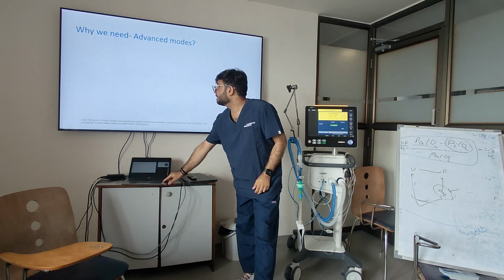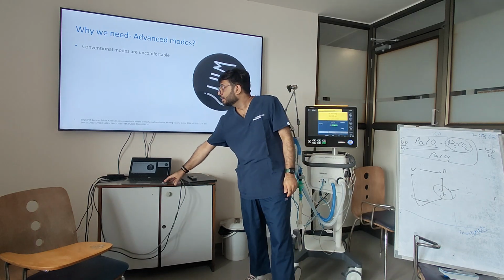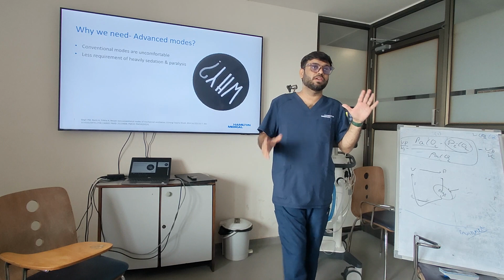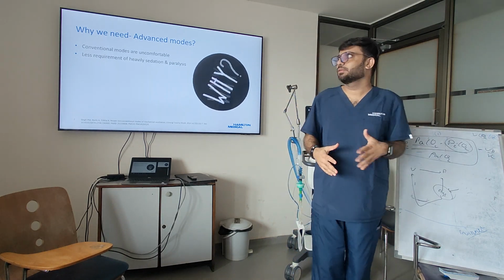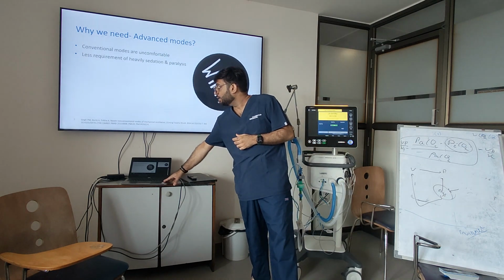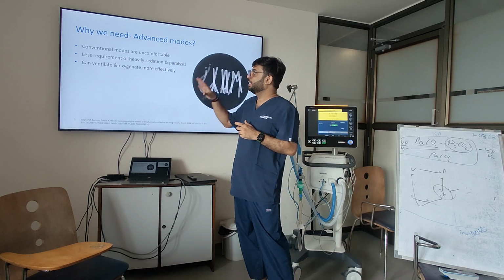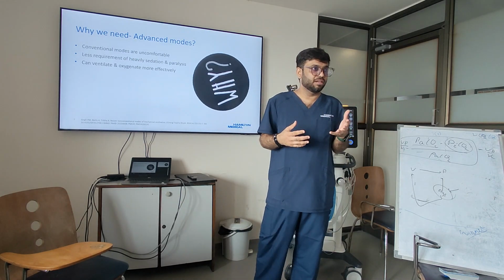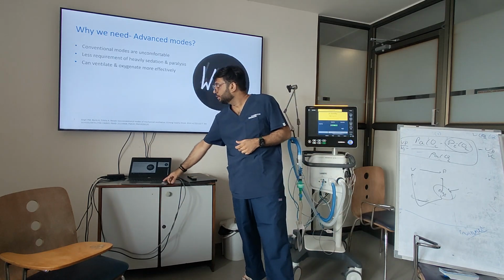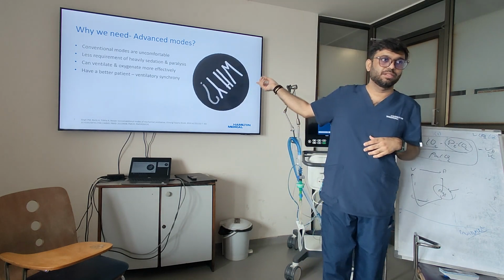So in that context, why do we need the advanced modes? We need them because the conventional modes are more uncomfortable if we do not monitor the patients very aggressively or very frequently. Advanced modes require less sedation and fewer paralytic drugs. They can ventilate and oxygenate more effectively because they finish the loop on their own and adapt on their own. And then you will have better ventilator-patient synchrony, which is a very important point.